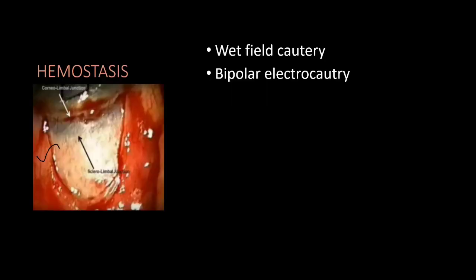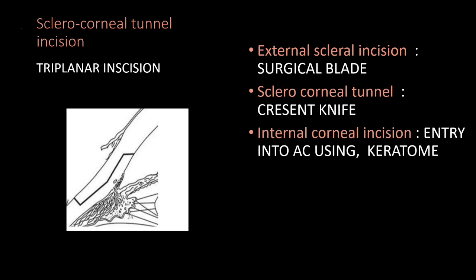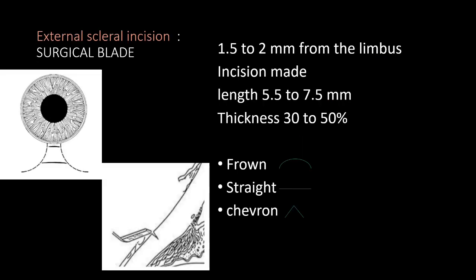This is the clinical image of the conjunctival flap showing the blue limbal area. After creating the flap and performing hemostasis, we proceed to make the sclerocorneal tunnel. We then enter the anterior chamber by internal corneal incision using a surgical blade to make a self-sealing incision.